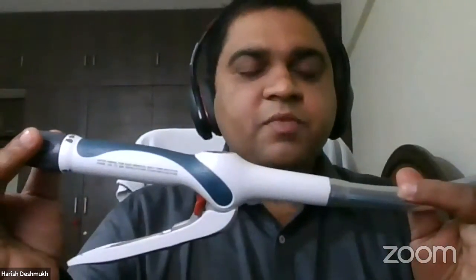Then coming to the other types of staplers, we have the circular stapler, used basically for your end-to-end anastomosis. So we have the two ends in circular staplers. We have the rotating knob. You can see here, this is a rotating knob. We open up the anvil here. This is the anvil. The circular ring is the anvil.